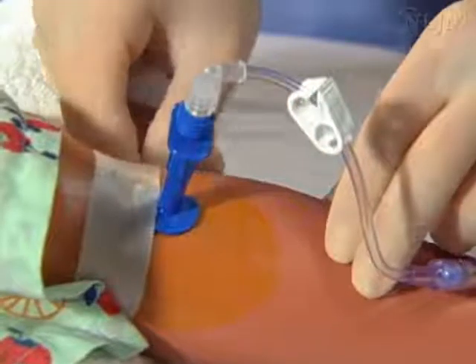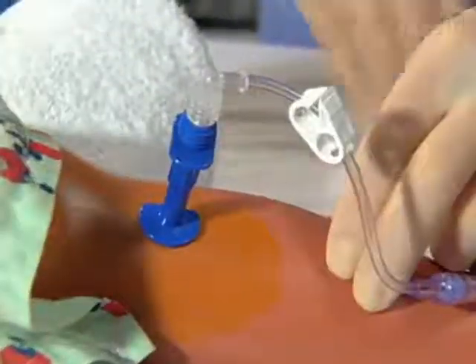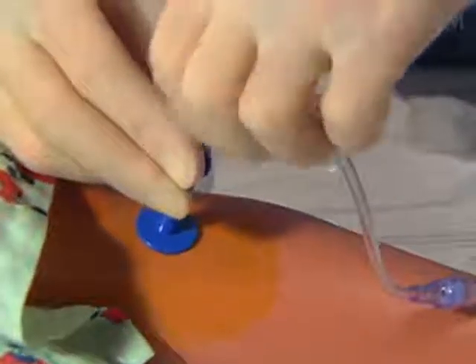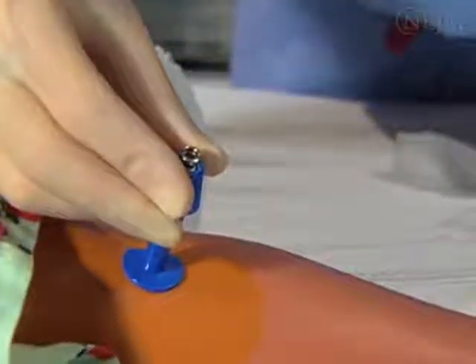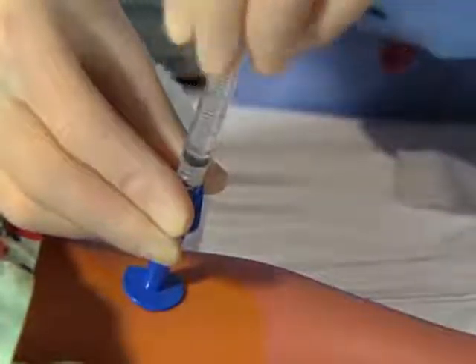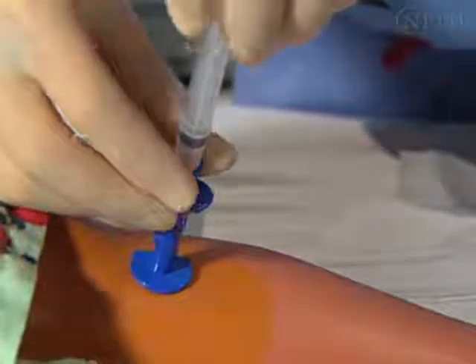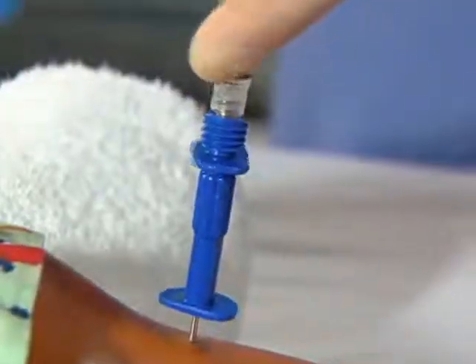To remove an intraosseous needle, loosen and remove any tape or dressing securing the cannula and extension tubing from the skin. Stabilize the extremity. Firmly grasp the needle flange or connect a sterile luer lock syringe to the hub. Rotate the syringe and catheter clockwise while gently pulling the needle from the extremity. Place a sterile occlusive dressing over the insertion site.